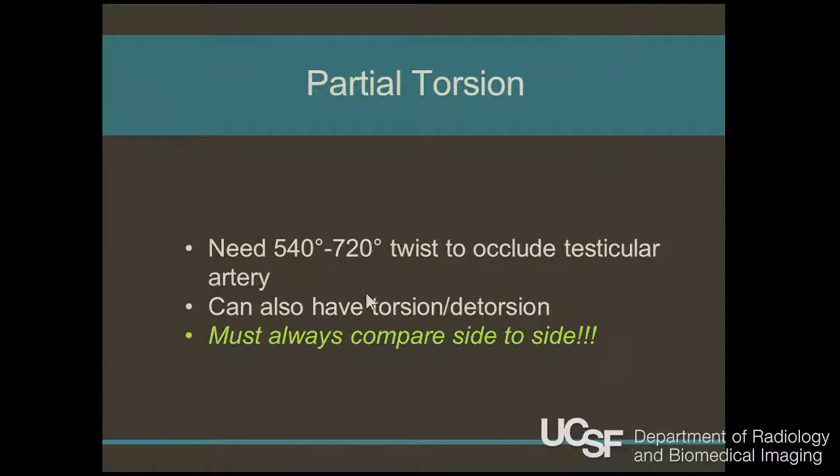And if you don't have that, you will see flow in that torsed testicle. And so flow present does not necessarily rule it out. So that's just a really important case.